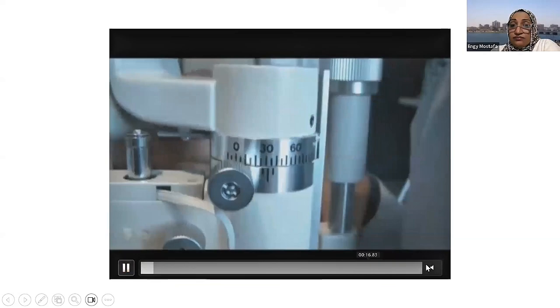So what's the principle behind that? It's like the sun falling at a faraway point, but its reflections make you see how the ripples on the water appear. This is the same intention. So how do we do it? We decouple. What's decoupling? It is that we are making the light fall away from the viewing system. We want the light to fall on the limbus, and we are going to examine the cornea back and forth.